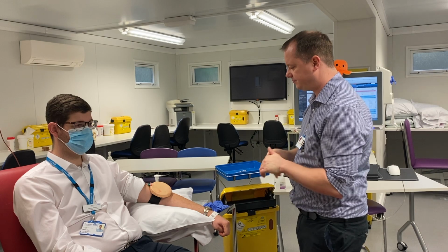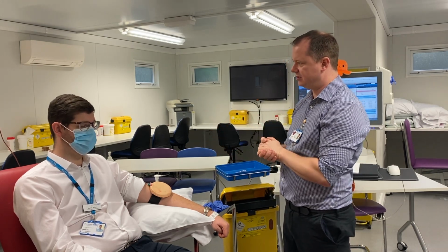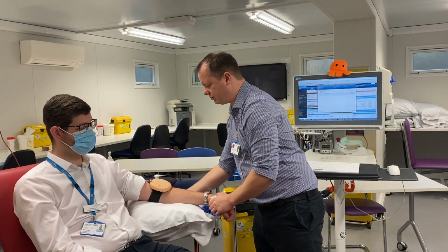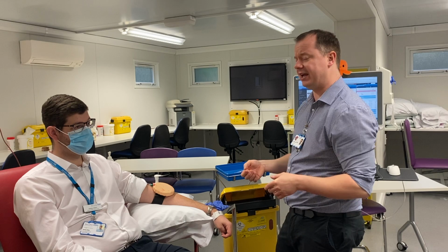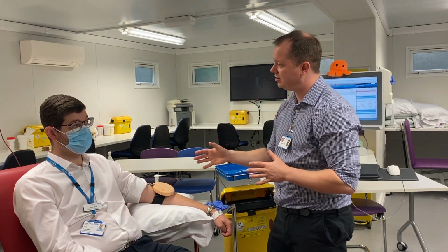I then need to try and get the patient in a good, comfortable position. Are you in a comfortable position? I am. Good. And then I need to make sure that I can access the vein here. I've made sure I've got a pillow underneath the patient, their arm is outstretched, and I can access the bit that I want to. I'll also check with the patient that I can actually use this arm. Is there any reason why I can't use this arm?